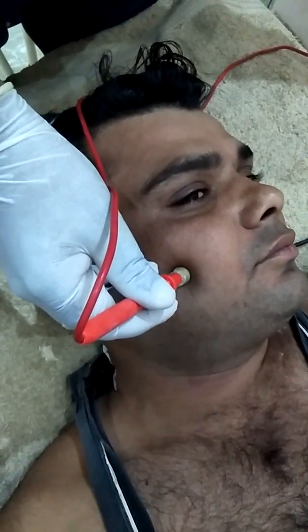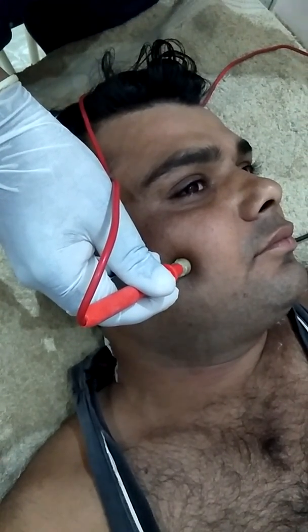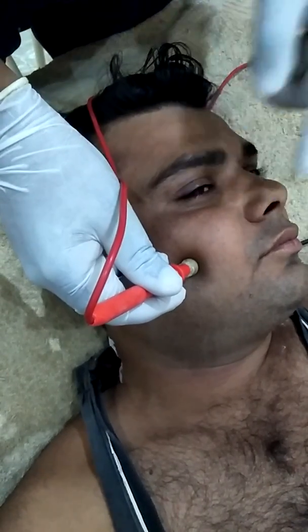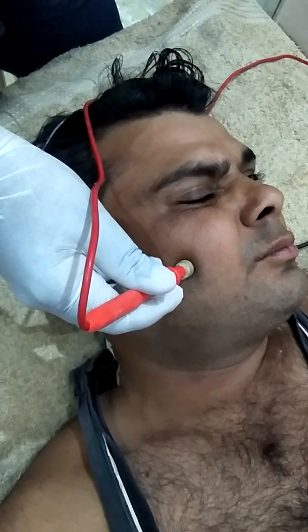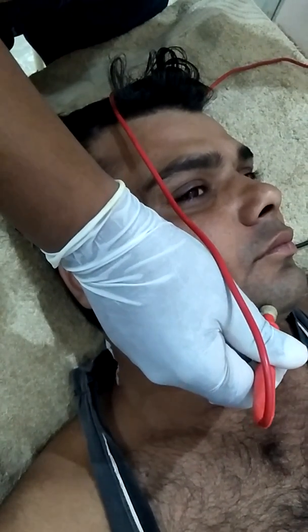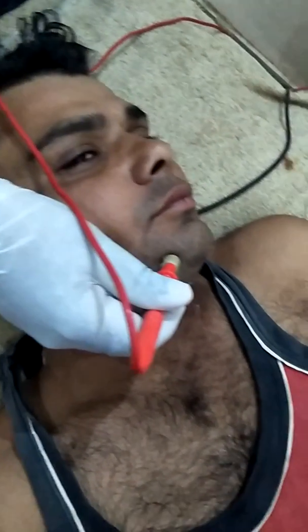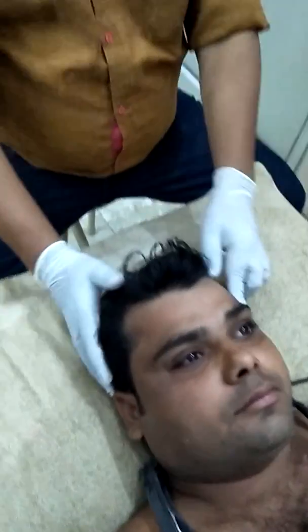Again, this is the zygomatic area. Increase the intensity, you see the most movement of the upper lip. And the third branch is mentalis. When you place it in this area, this is electrophysiology.